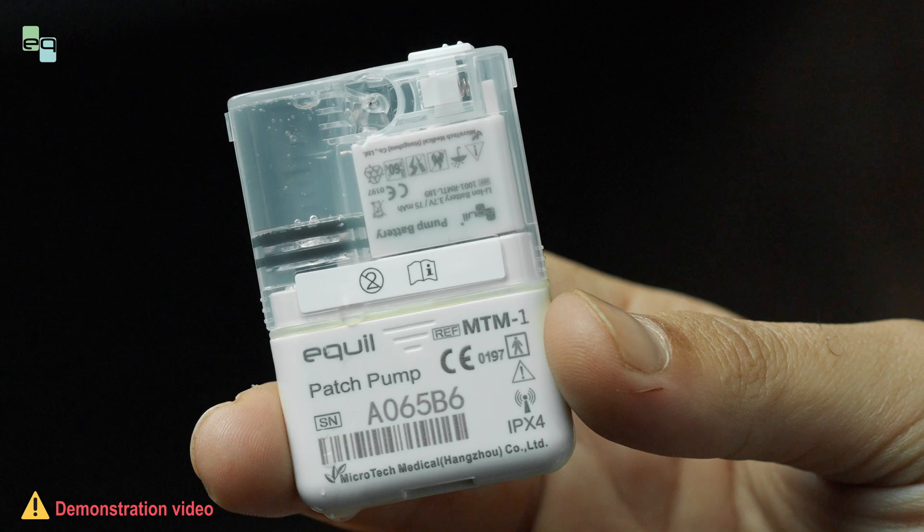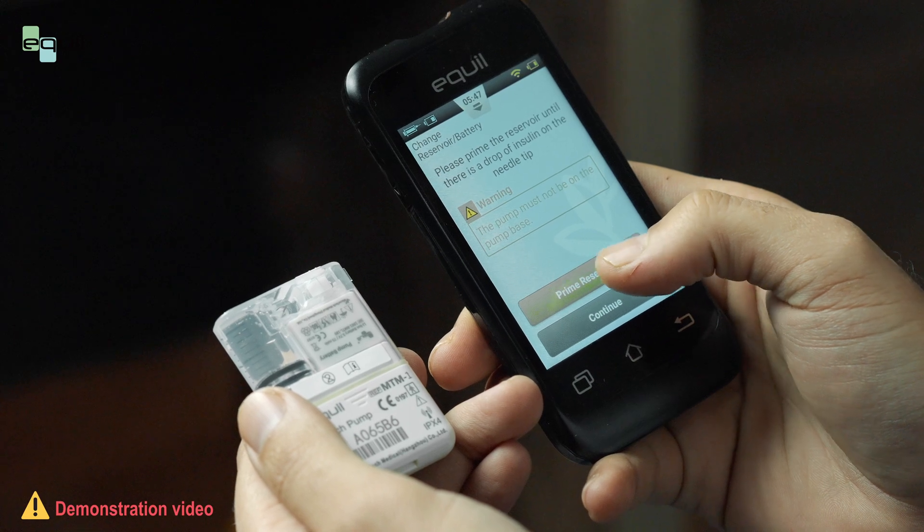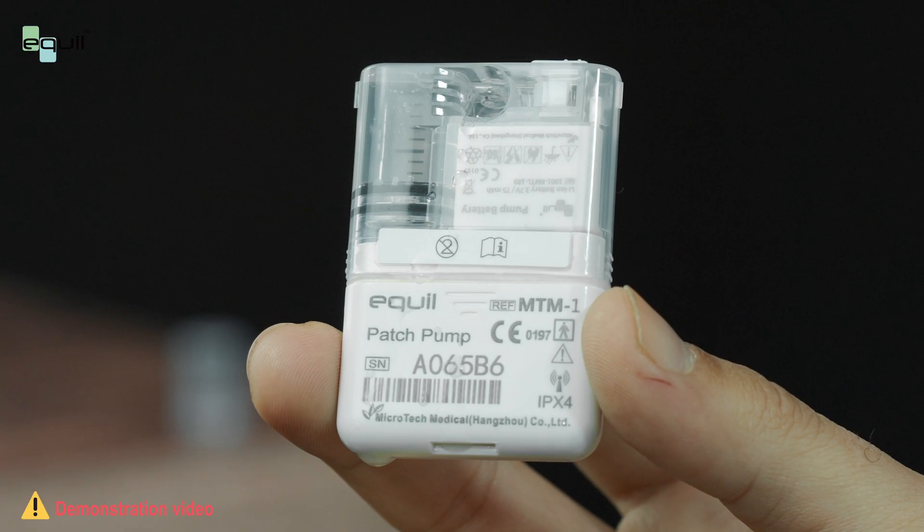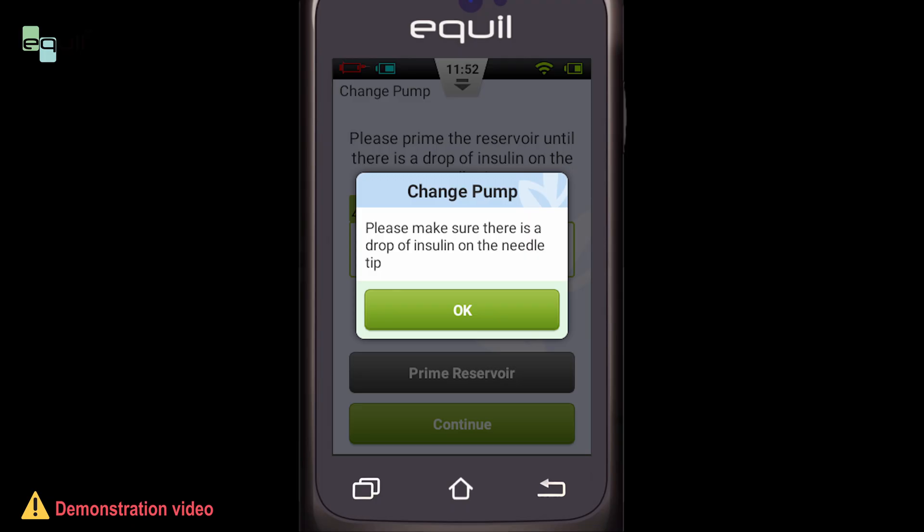Press Continue. Hold the pump in the position shown in the video and select Prime Reservoir. Then you should see an insulin drop on the reservoir needle tip, which means your pump is ready and a confirmation message will pop up asking for your assurance that there is an insulin drop. Select Yes.